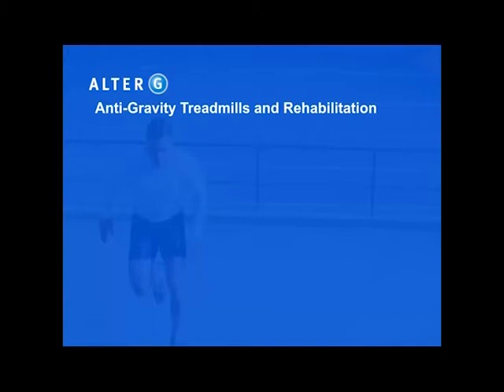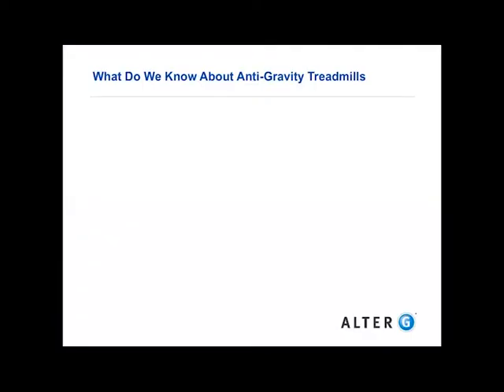So let's move on now to talk about how you use this technology, how you use this body weight support in rehabilitation. So what do we know about anti-gravity treadmills? Well, the AlterG is safe. That was established at NASA, and we have other research that also supports that. AlterG can assist in decreasing ground reaction force to the lower extremity.